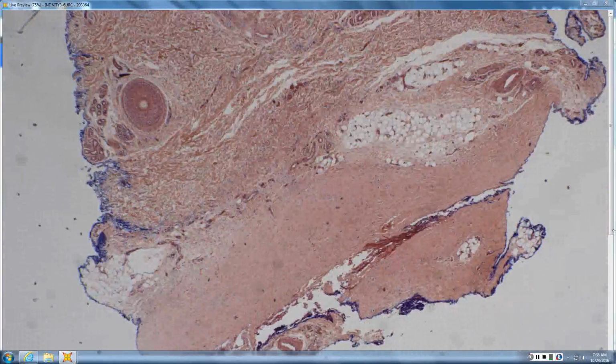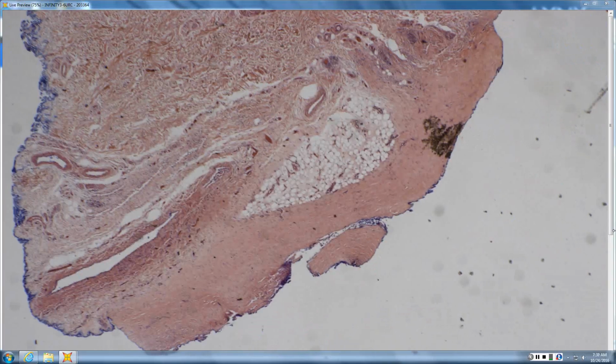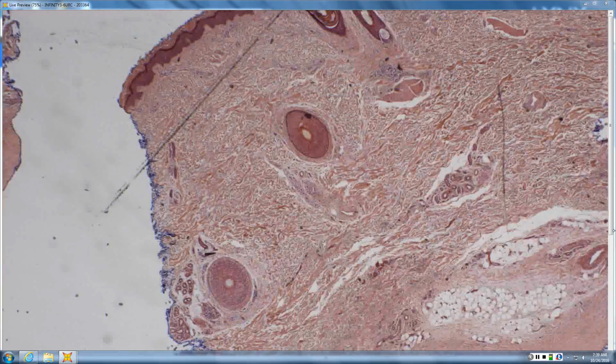So it looks like you had some degeneration of the collagen, sort of deeper. Yeah, and how would you characterize the collagen? It looks necrobiotic, kind of. Yeah, or sclerotic and hyalinized. There's no white space between collagen bundles. Mm-hmm. And it's all deep. So what would your differential be? So maybe a rheumatoid nodule or deep GA. So it absolutely could be that you're just seeing the fibrosis on top of a deep GA or rheumatoid nodule.